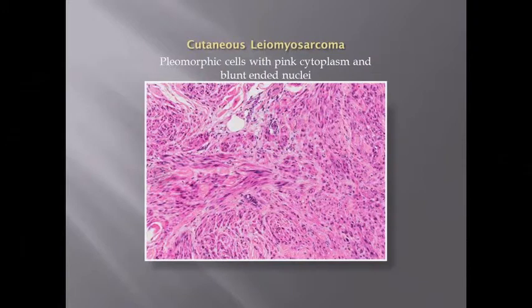The leiomyomas show bland proliferation of smooth muscle cells, they are purely dermal in location, and they do not exhibit features of extension into the subcutaneous fat. In addition, of course, if they have marked nuclear pleomorphism and mitotic activity or necrosis, then they automatically get a diagnosis of leiomyosarcoma.